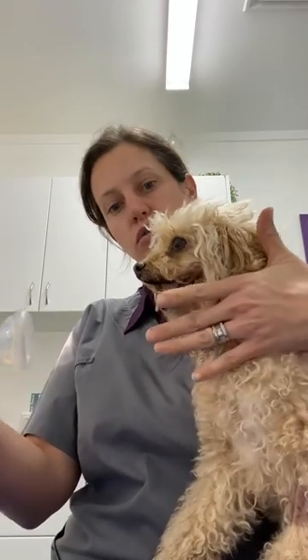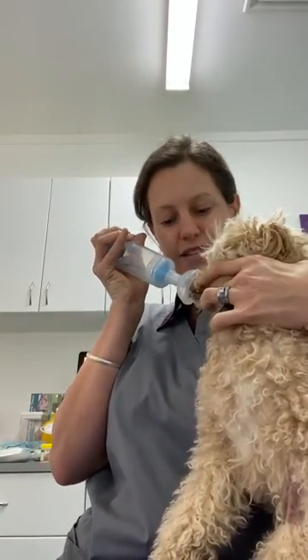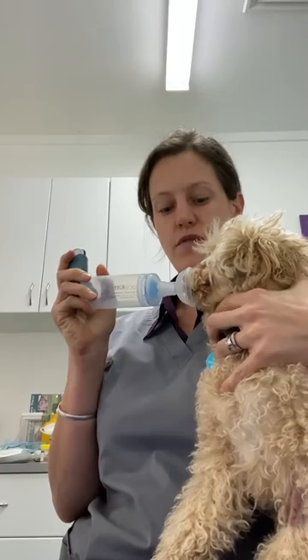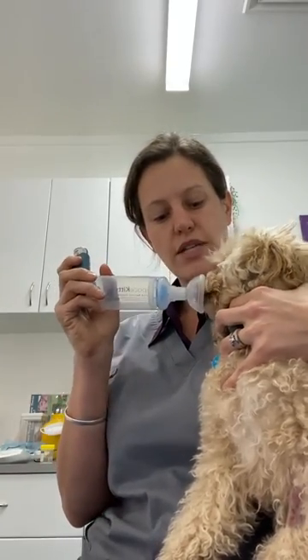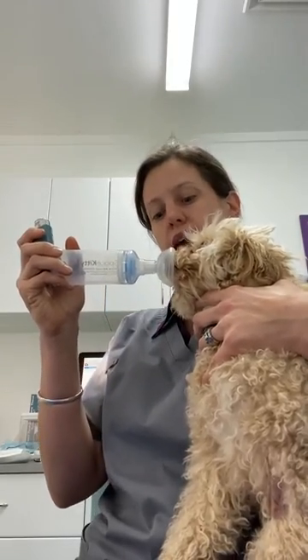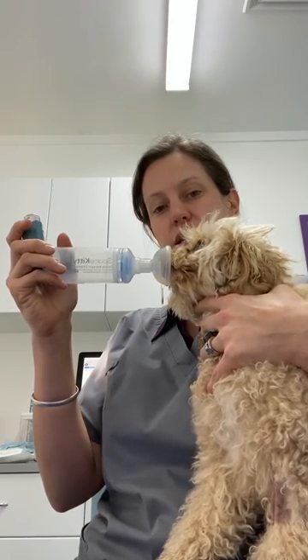You will then hold it over their nose with their mouth closed. Give a little puff and then wait. What we're aiming for is about six to eight breaths that Miss Holly is taking while that's on her nose. Sometimes they won't tolerate that much, but that's the goal — it allows her to get a couple of nice big breaths of that Ventolin in.